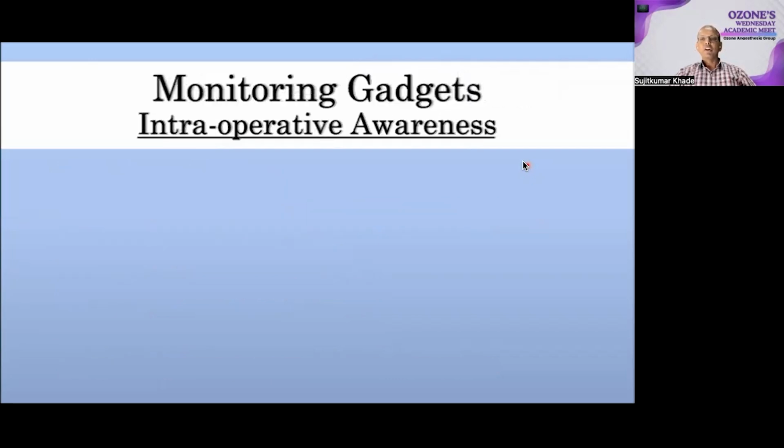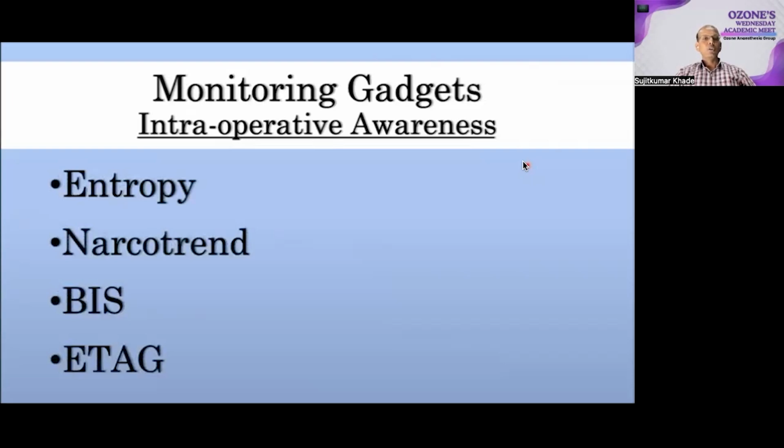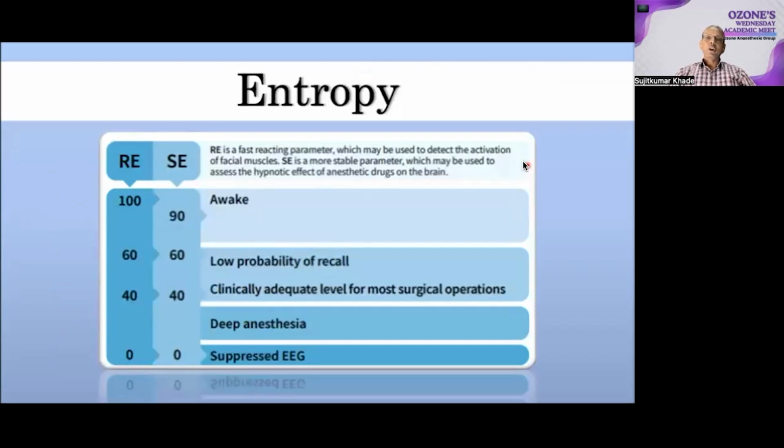There are a number of brain function monitors that use proprietary algorithms to process the EEG and provide data to anesthesiologists with a value intended to represent the depth of anesthesia. In addition to the BIS monitor, other monitors include Entropy, Narcotrend, and SedLine, but BIS is the most widely used one. Entropy monitors analyze a single-lead frontal EEG, typically using a sensor with 3 electrodes placed on the patient's forehead. The monitor generates two indices, state entropy and response entropy.